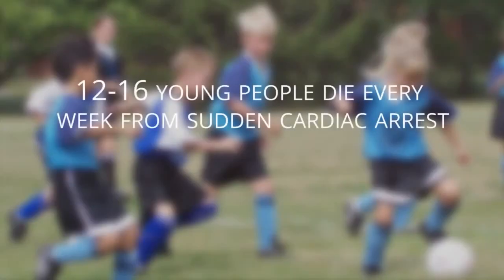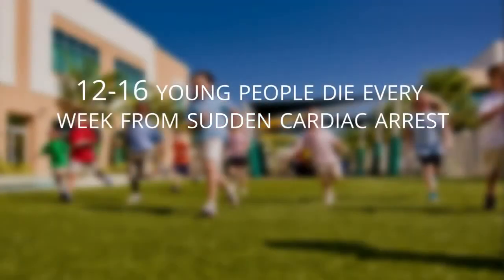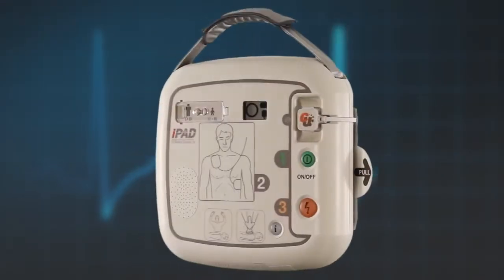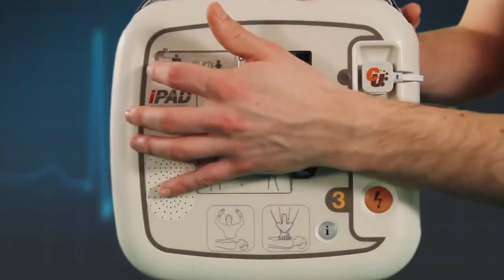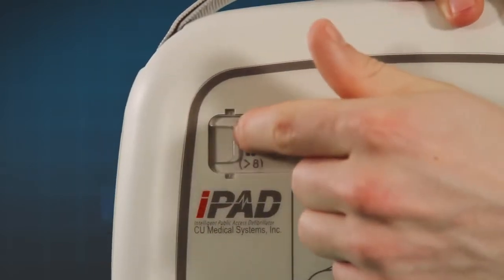Whilst the majority of cardiac arrests are on casualties who are of adult age, and the incidence of cardiac arrests in children is rare, they are on the increase. The iPad SP1 AED has a feature that allows it to be used on children should the need arise. There is no need to change the pads — simply lift the cover and slide the switch on the front of the AED to select child mode.